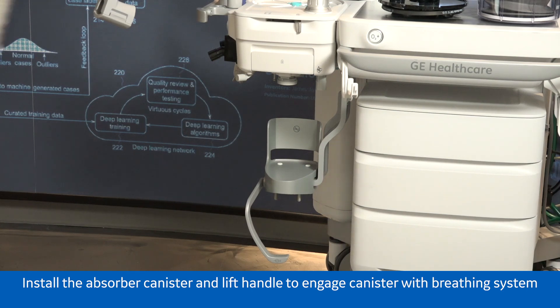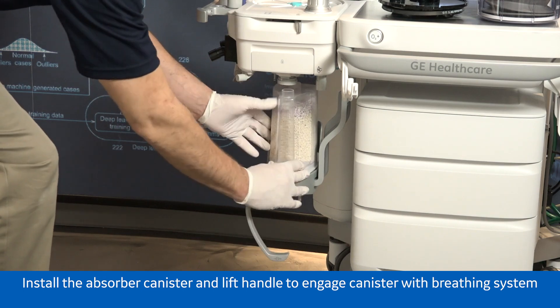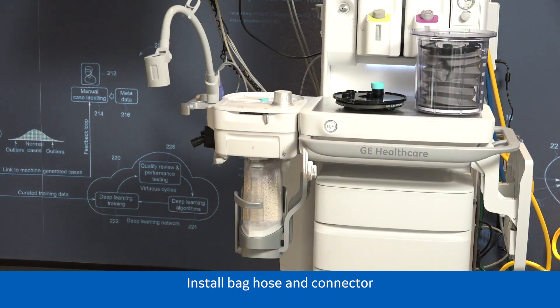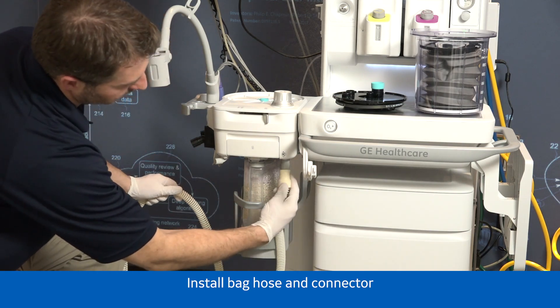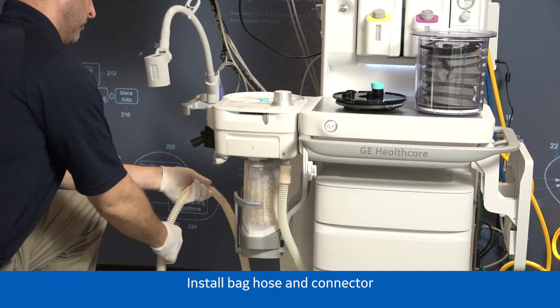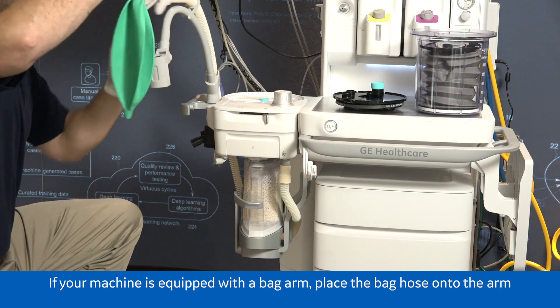Install the absorber canister and lift handle to engage the canister with the breathing system. Install the bag hose and connector. If your machine is equipped with a bag arm, place the bag hose onto the arm.